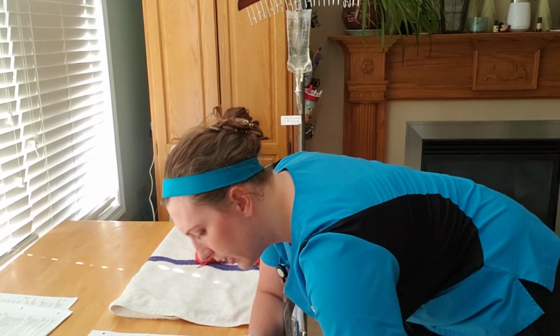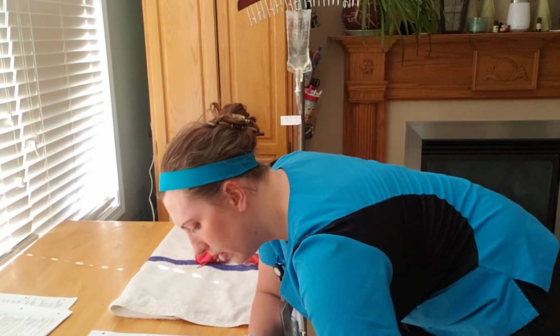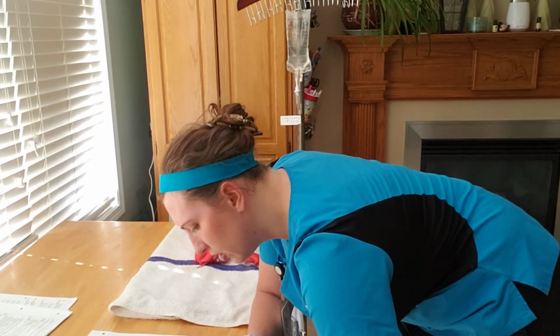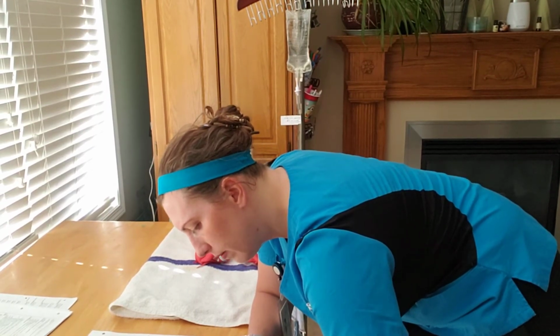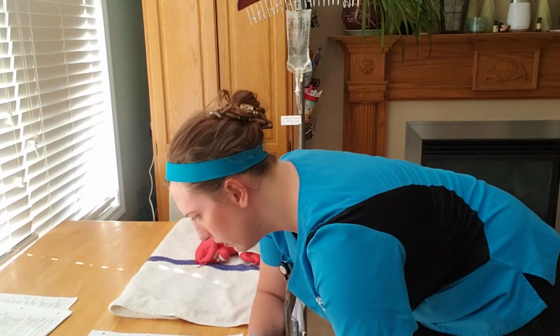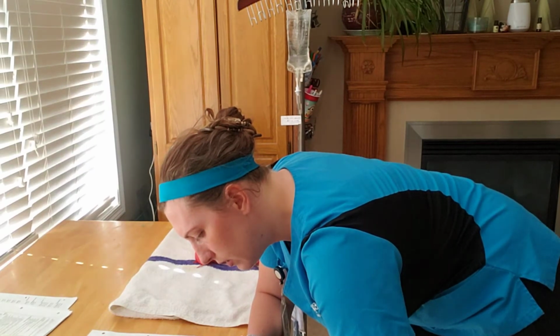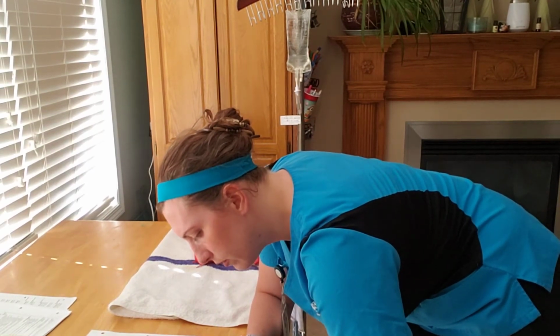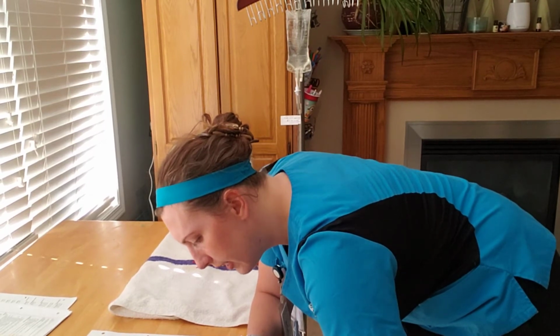I'm also going to put her ID number here, 61497-3042. This is added by me. And this is due tomorrow, 2021, June 26th at 0700 hours.